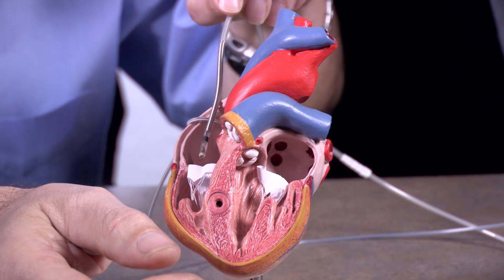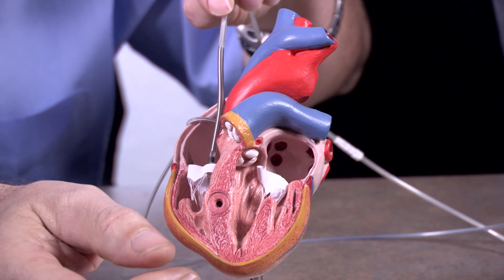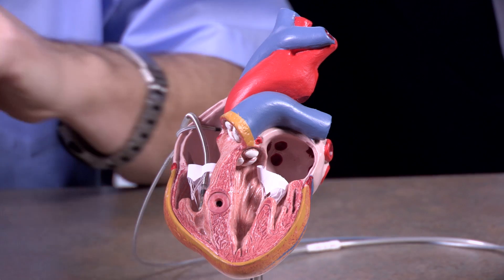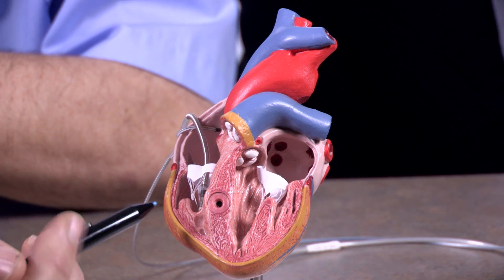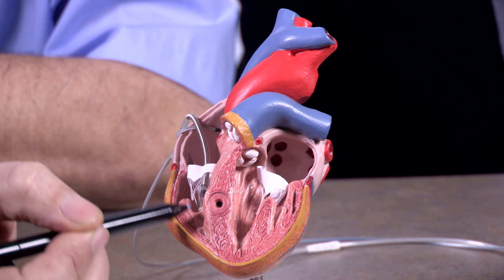And the interesting part is at the output. I'm going to take this second lead down here, and I'm going to thread it into the right ventricle down there. And it has a trigger — a ventricular trigger. And when this thing triggers, the ventricle will contract.